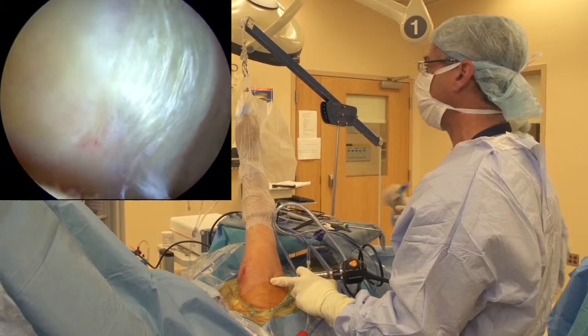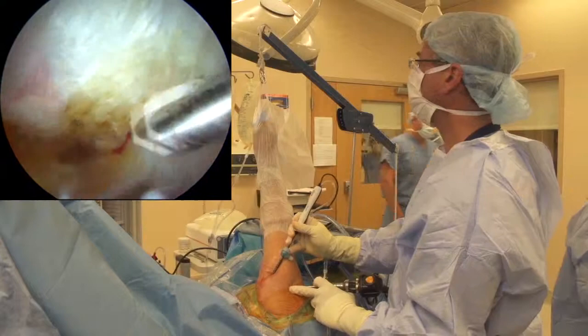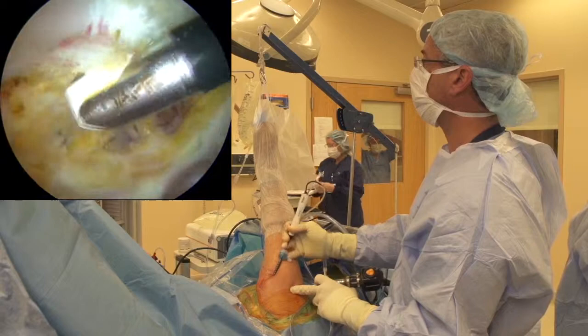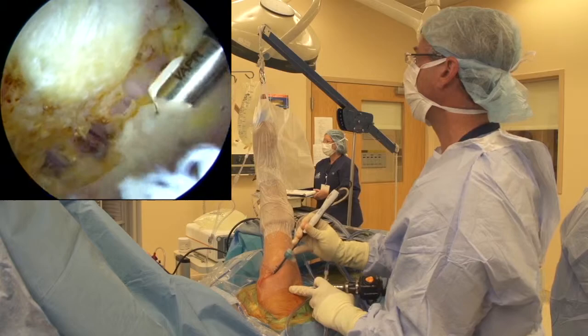What I like to do in these situations is just take down the CA ligament for visualization purposes. I like to have an anterior portal and I'm not going to do a major acromioplasty - those days are done. Just for visualization purposes we're going to make an anterior working portal as well. There's really no reason for an aggressive acromioplasty in this patient because we've got excellent visualization into the subacromial space.